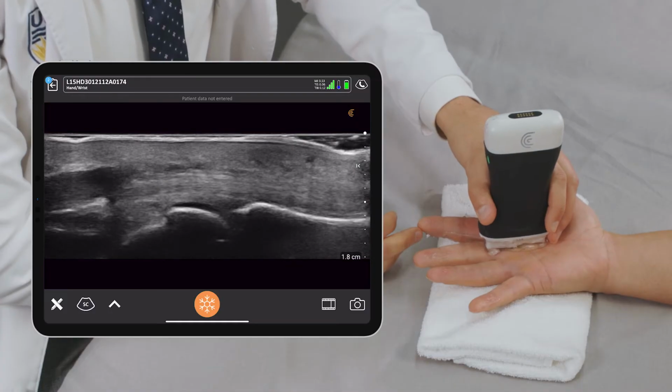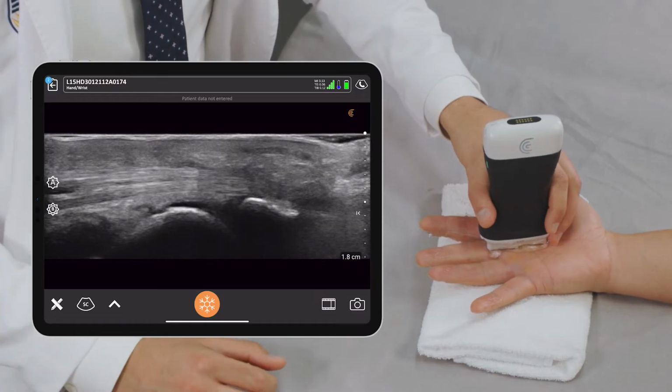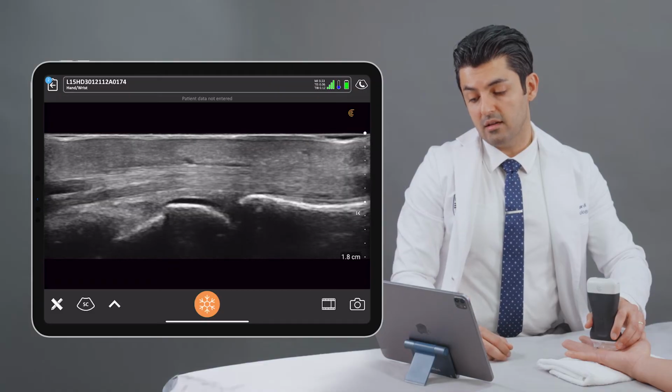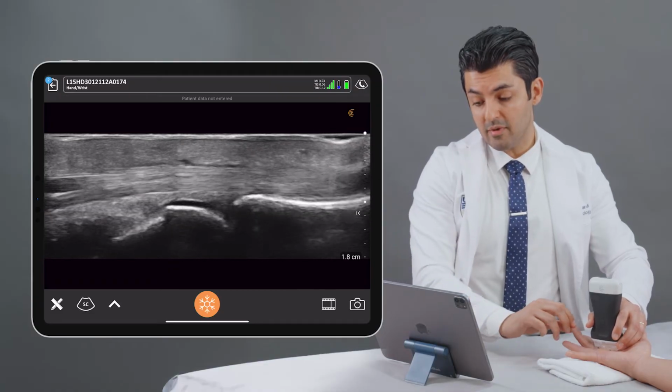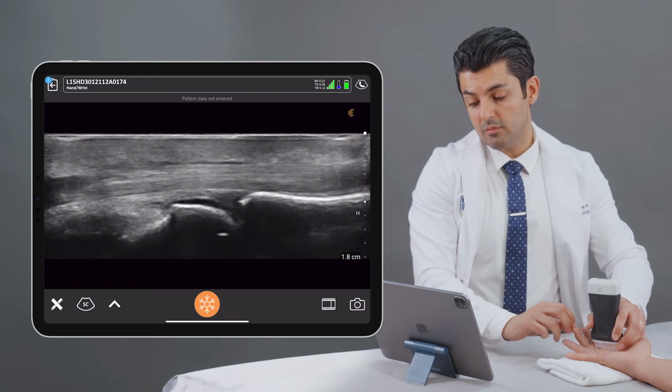So from a diagnostic clarification perspective, ultrasound has really come out in terms of assessment of inflammatory arthritis, vasculitis, some of our conditions like lupus that have lots of different organ manifestations. We're getting more and more insight of how to use it in those conditions. And also we can use ultrasound for assessing response to treatment.